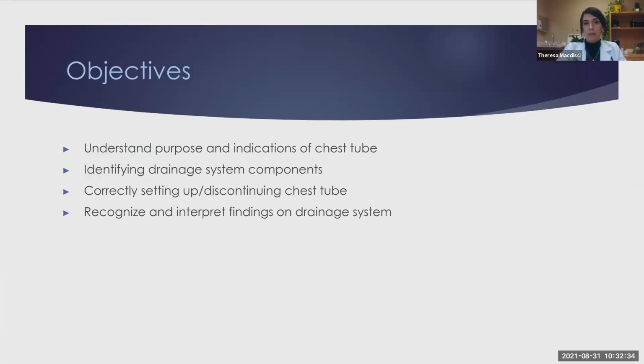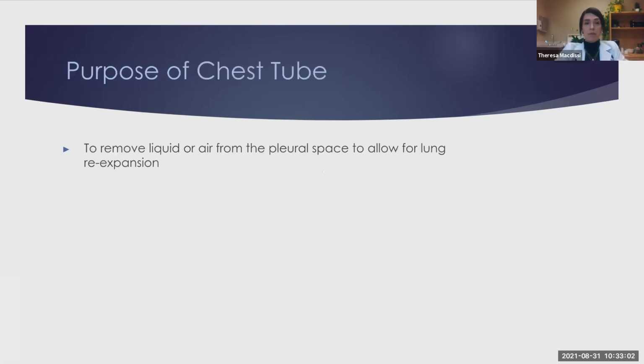I know a lot of us have been in medicine for some time and have, at some point in our career, come across a patient with a chest tube. Today is kind of the basics of chest tubes. For some of you, it may be old hat and just a nice review, but for others, perhaps you haven't had a patient with a chest tube in a while. So hopefully this will be some good reminders on how to set up and how to interpret the findings on the drainage system itself. So the first thing is the purpose of the chest tube.